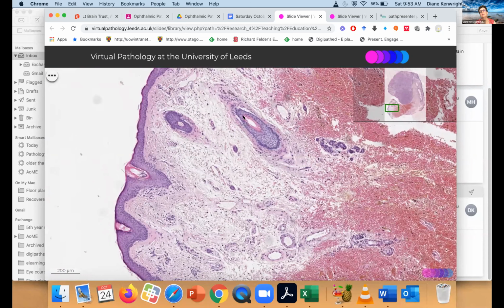Good. Can we see it's got clear margins without seeing more slides to see either side of the tumour? That's a good question. Yeah, I think yes, I think it's a good way from the margins. Yeah, you say in this slide it is clear of the margins. Yeah. Of course, you can never examine all of the margins of everything.